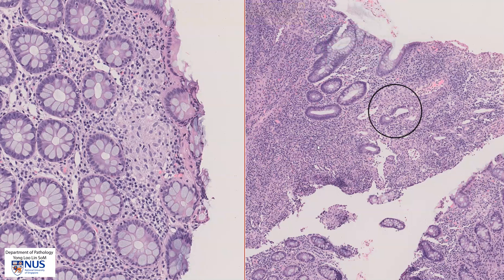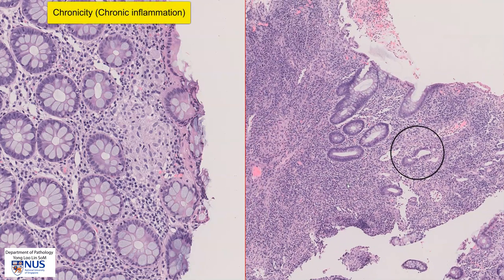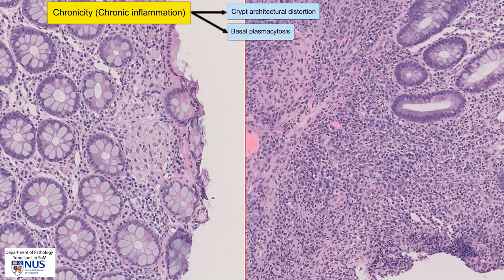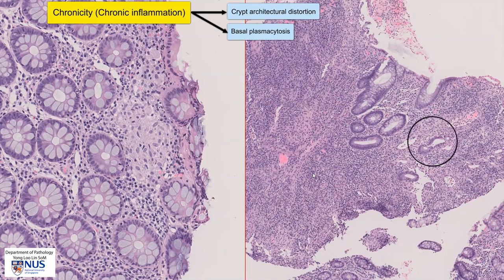So we have seen some features of activity, such as ulceration, cryptitis, as well as granulomatous inflammation. Let's look for some features of chronicity. In this particular example, we can see that there is shortening of the crypts, there is branching or some architectural distortion. And also over here we see a lot of plasma cells at the basal aspect of the mucosa, and this is known as basal plasmacytosis. These features are indicative of the presence of chronic inflammation or chronicity.